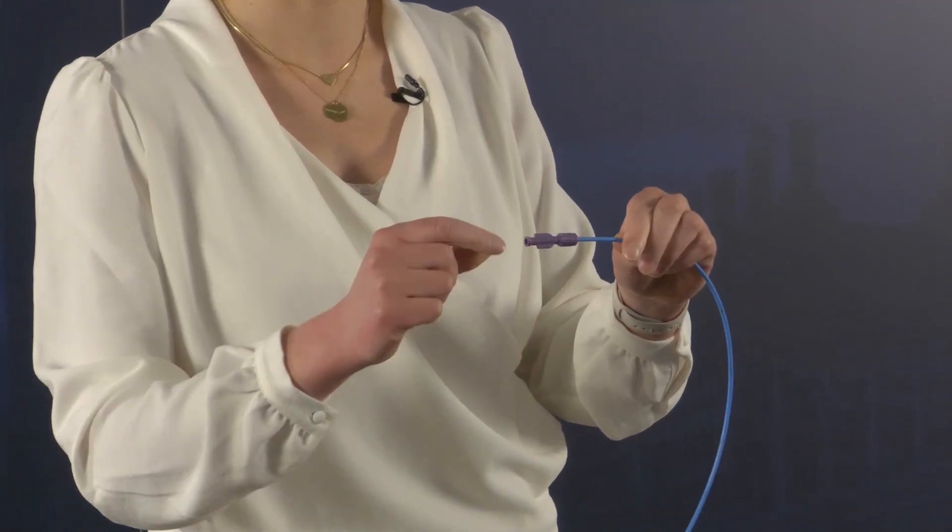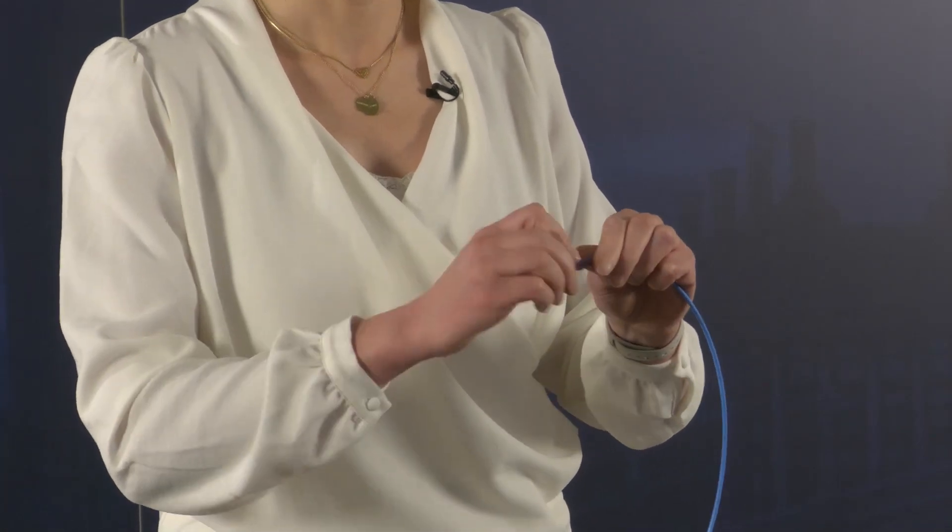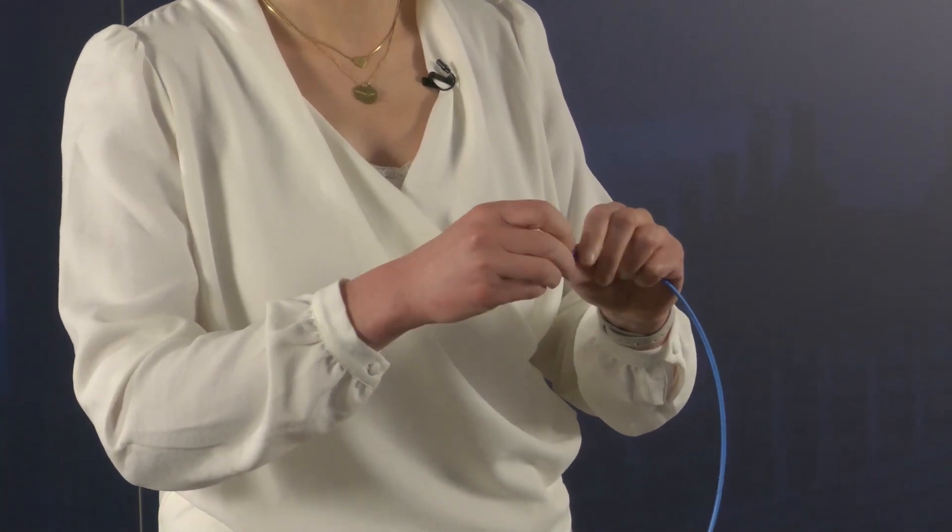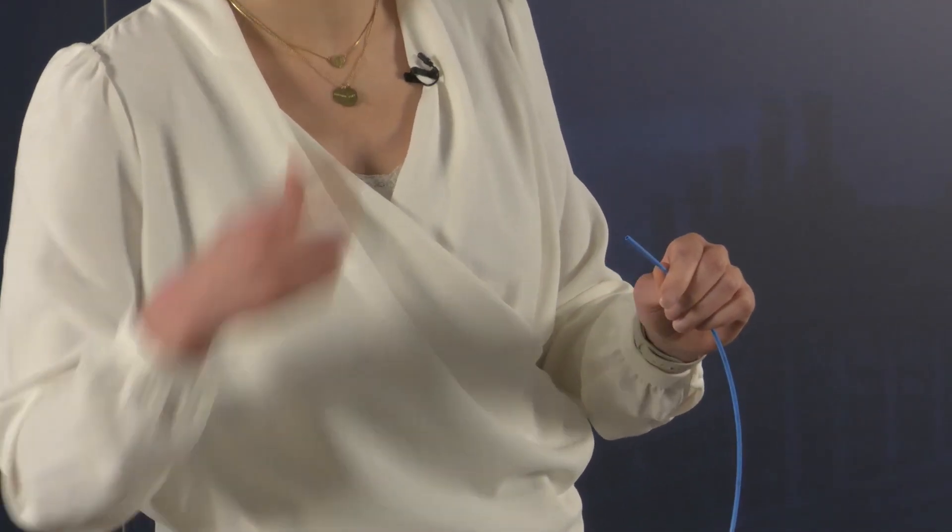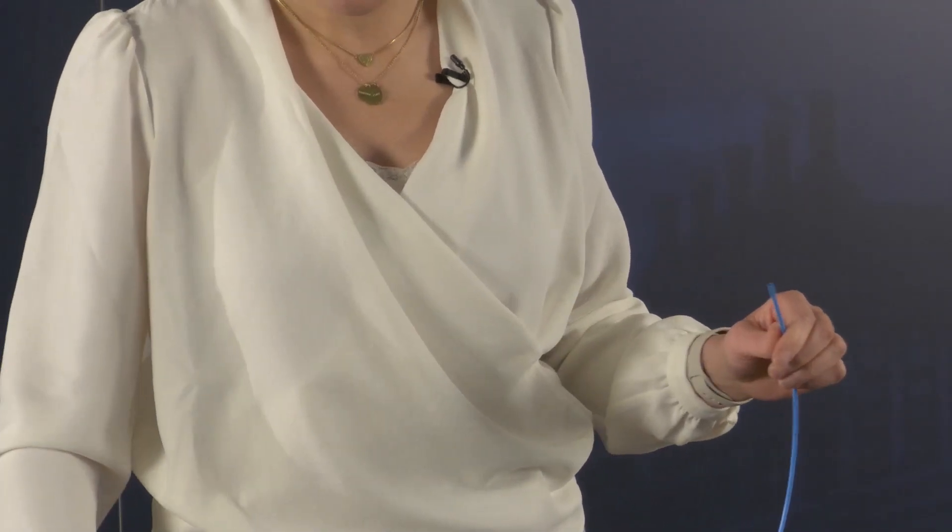You can put it at the end, just use a luer lock, flush this with some water, then take this purple connector off and put it next to you. You need that once the tube has been rerouted via the nose.